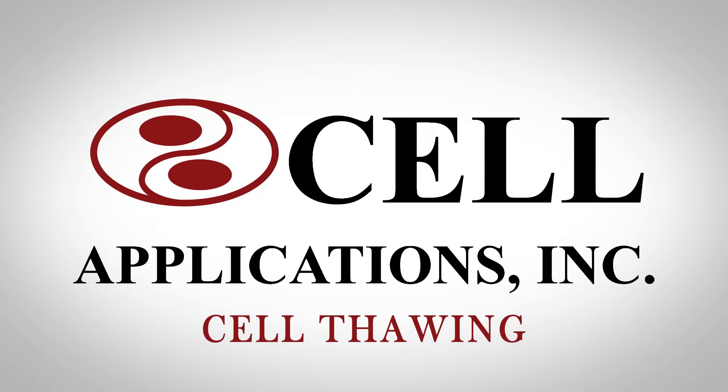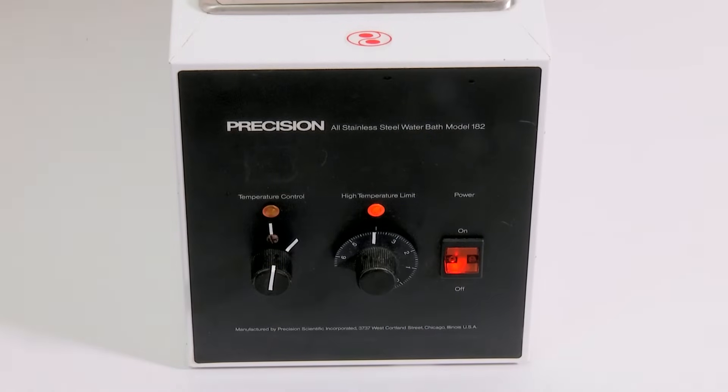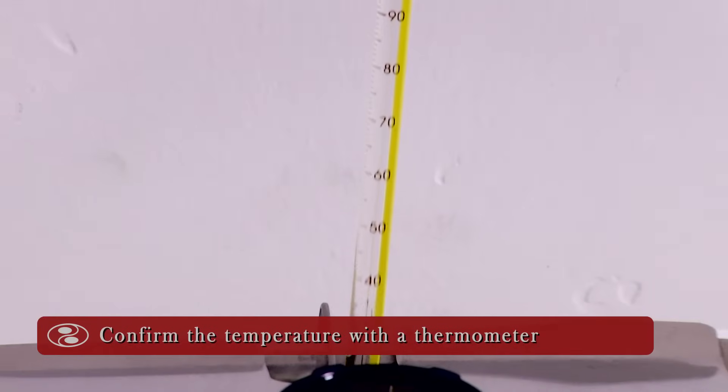Cell thawing. To thaw, set water bath to 37 degrees Celsius. Confirm temperature with thermometer.